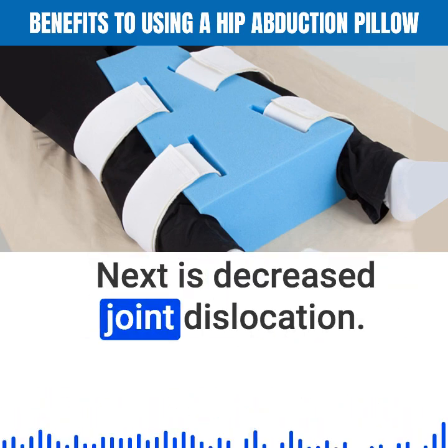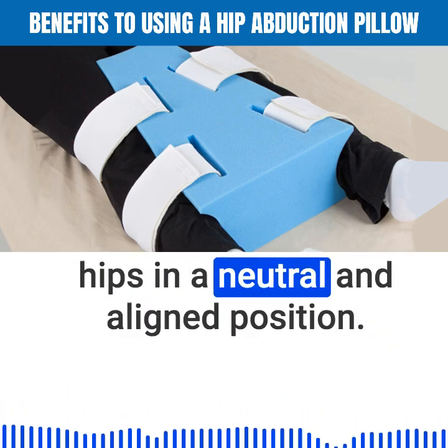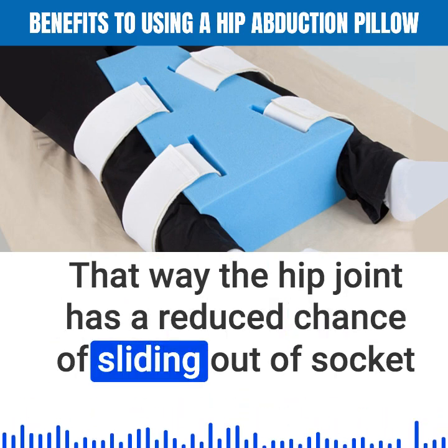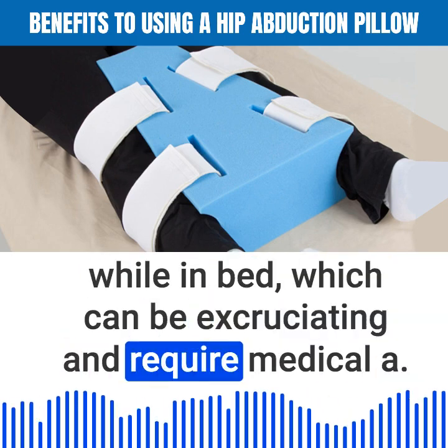Next is decreased joint dislocation. The goal of the pillow is to keep the hips in a neutral and aligned position, so the hip joint has a reduced chance of sliding out of socket while in bed, which can be excruciating and require medical attention.